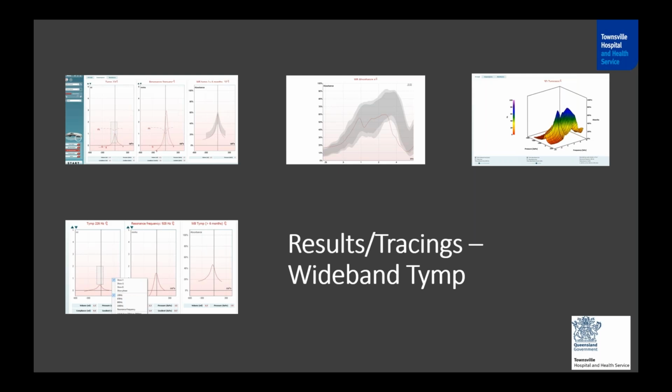Because what happens at the middle ear is, you can have a reflectance that is a composite of what's happening with the different inner structures. So whether the grommet is blocked or not, those structures still contribute to the absorbance or the reflectance. That's why even in tympanic membrane perforation, you can still measure the absorbance.